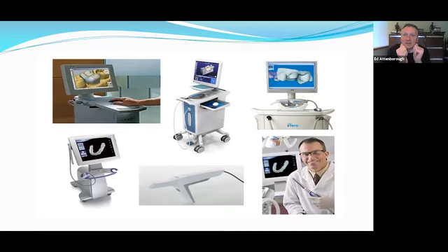So that means that the devices are suitable in terms of accuracy in certain indications and less suitable in others. And we need to have that at the back of our minds, that there's a measurement uncertainty that's caused by the software interpolating the data as it's recorded from the wand and turning it into a 3D file.